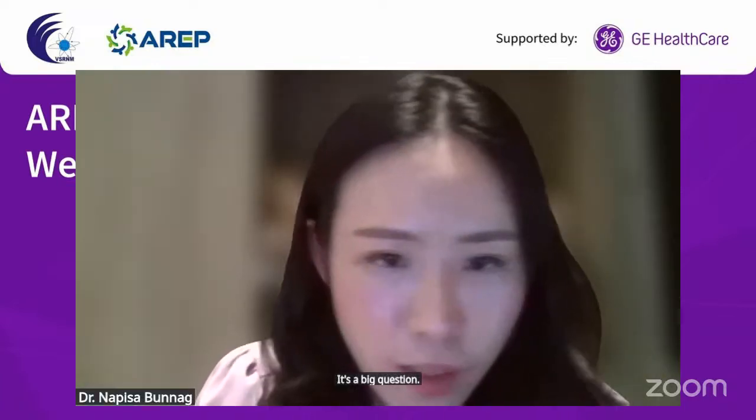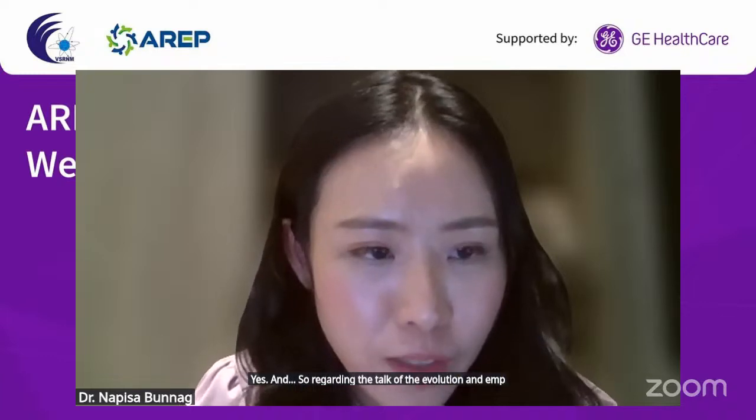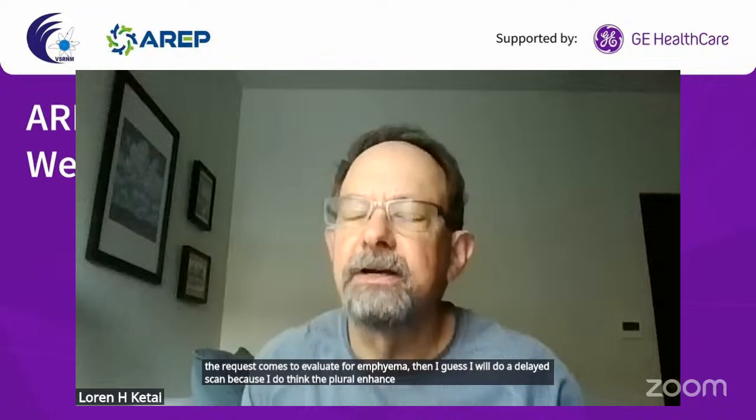Regarding the talk of the effusion and empyema, we have the question about whether we need to delay the scan to see empyema. That is a great question. If the request comes to evaluate for empyema, then I will do a delayed scan, because I do think the pleural enhancement is more conspicuous. But I don't think it's absolutely necessary.